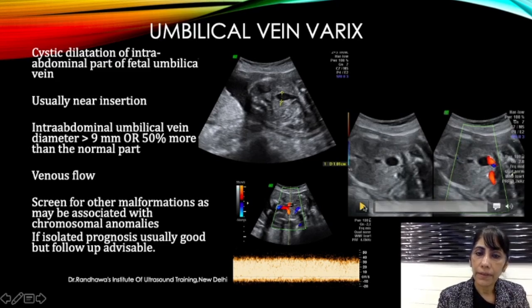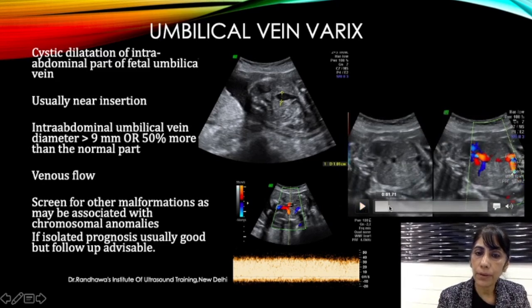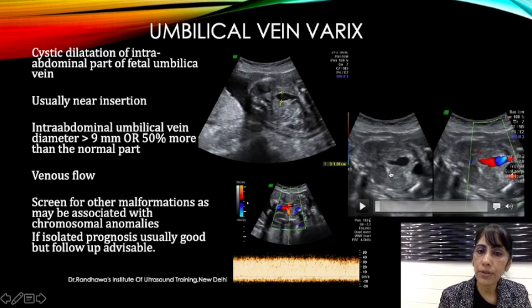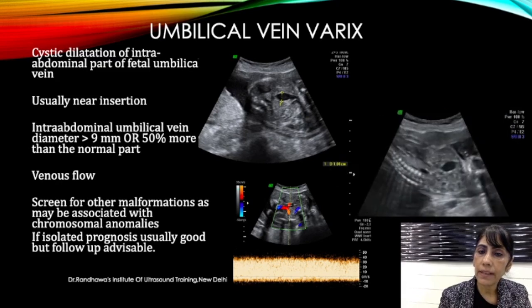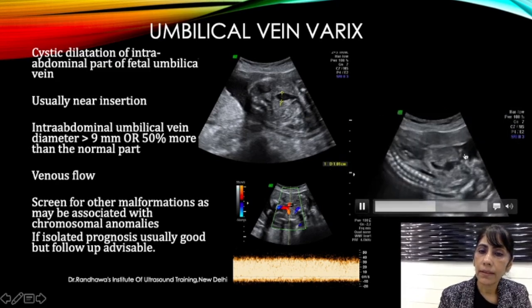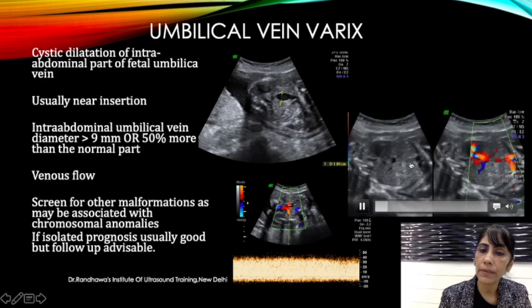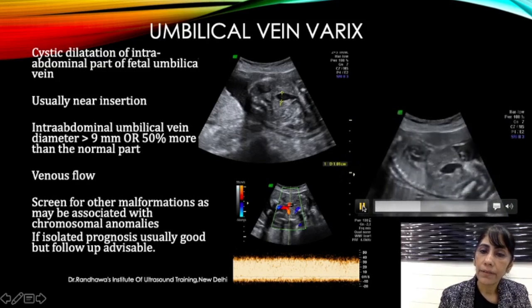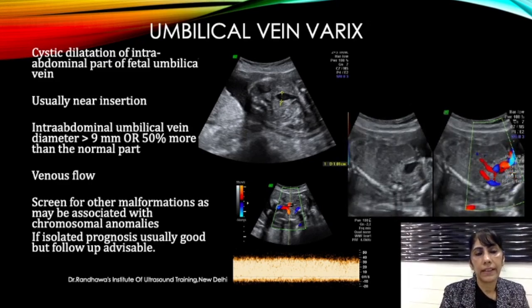Now let us look at the video. I will move slowly so you can make it out. This is the area — you can compare this dilated portion with the normal portion and by appearance alone you can tell it is much more dilated. When measured it was more than 9 mm, around 10 mm. With color applied, you can see the portal area, and in the longitudinal view the dilated umbilical vein part is clearly visible — this part is normal, this part is also normal, and this part is distended. This is an umbilical vein varix. I hope this small topic added to your knowledge.